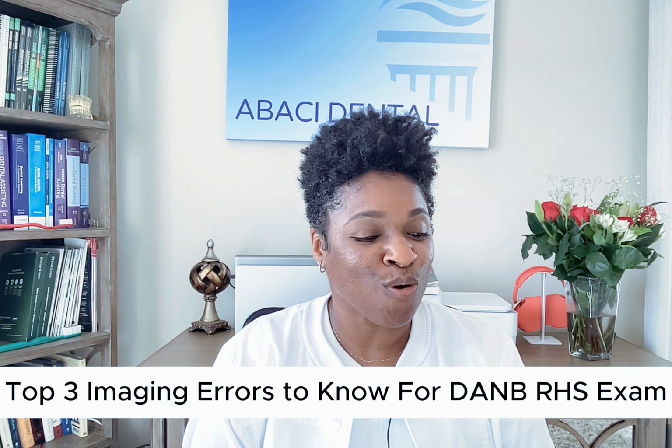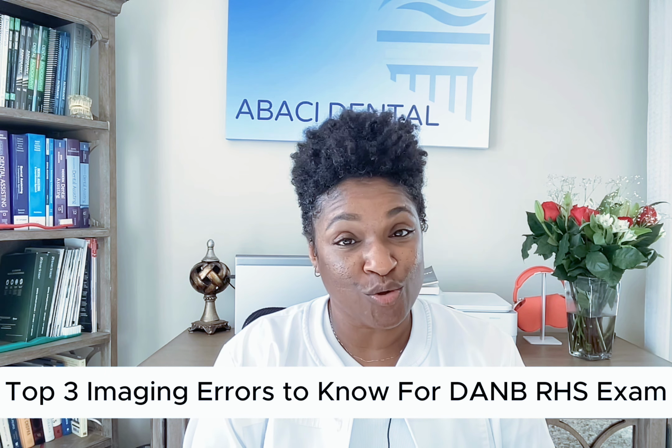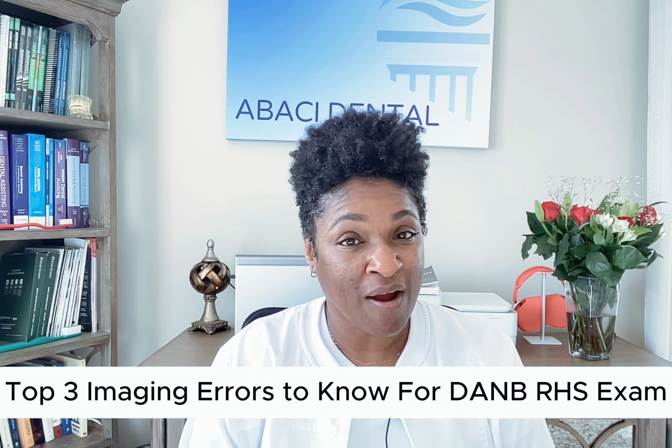My name is Nedra, and today we're going to be talking about the most common intraoral imaging errors you need to know for your DANB RHS exam. Now, this is just going to be a quick intro of the most common intraoral errors that you will encounter when taking dental radiographs, but you need to know this for the DANB RHS exam. And I know you guys like it short and sweet, so let's get to it.